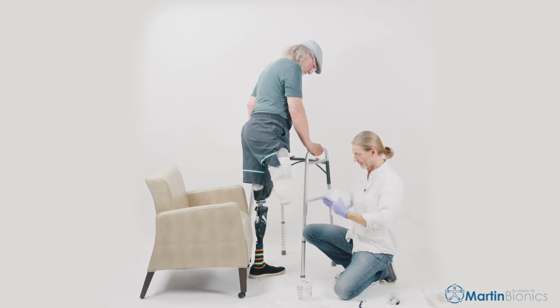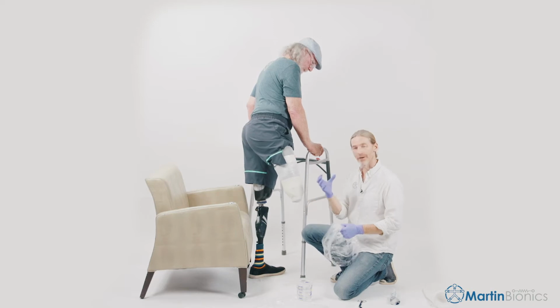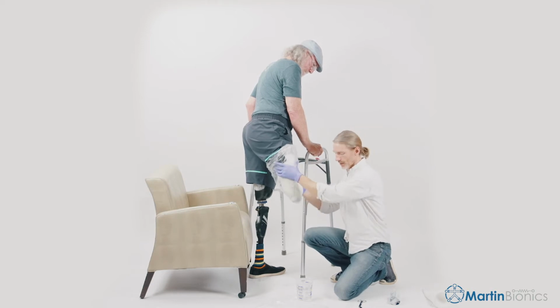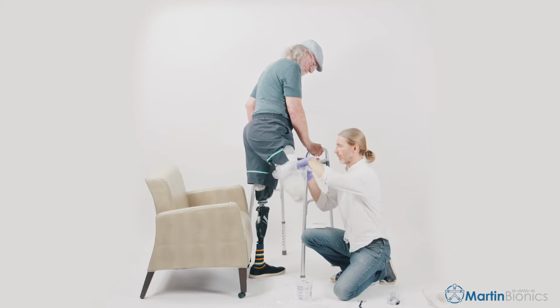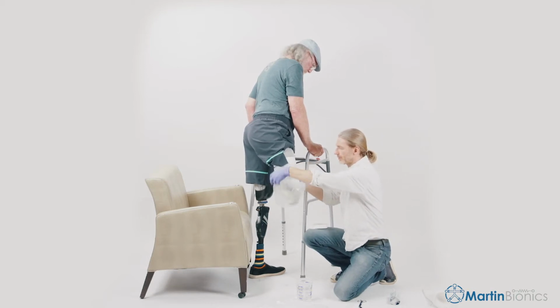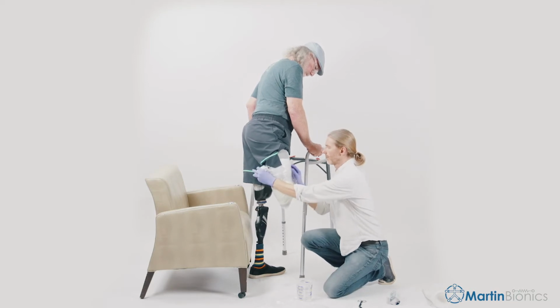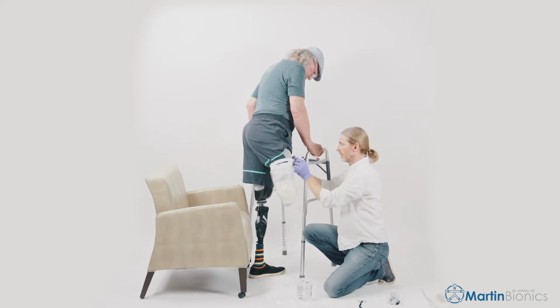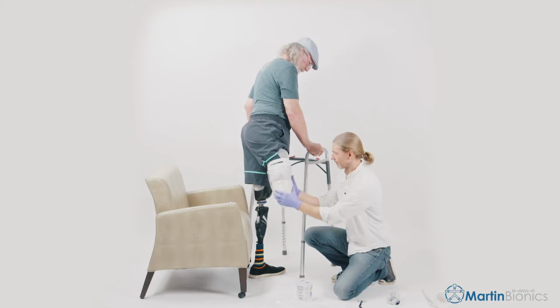Now that this cast is complete, this is our flexible inner socket. This 3M soft cast material has just a nice rubbery feel to it, like a Proflex inner socket. I'm going to put another barrier here so that the flexible inner does not stick to the outer frame, which we'll cast for next. Let's tape this in place. There we go. All right.